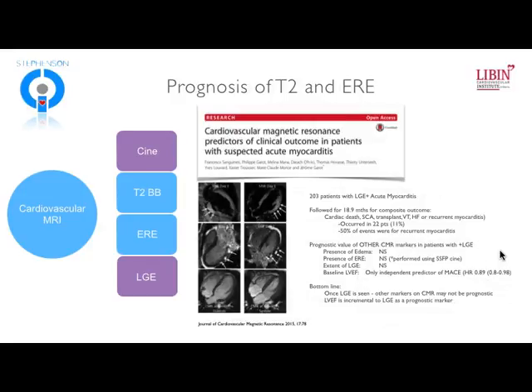Supporting this is another study that was recently published this year, in 203 patients that had the diagnosis of acute myocarditis established by late gadolinium enhancement. And so they set the bar pretty high and said, we're only going to call acute myocarditis if there's late gadolinium enhancement. And so they looked at the incremental prognostic value beyond LGE. And what they found was it really didn't matter once you have LGE whether or not you have much else. So the presence of edema was not significant. The presence of early relative enhancement was not significant. And actually the extent of LGE was not significant.